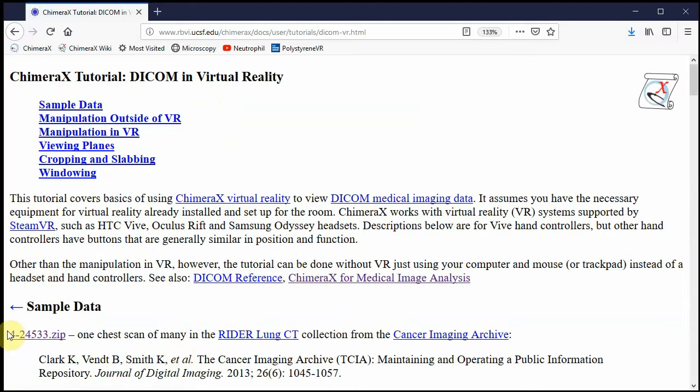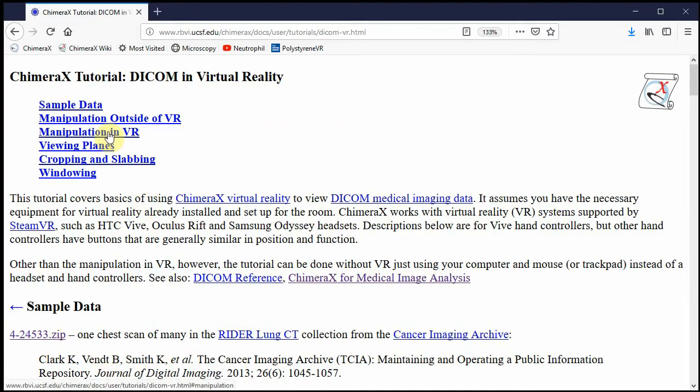The first thing to do is download some example data, a CT scan of human lung. I've already done that, so let's switch to ChimeraX and get going.